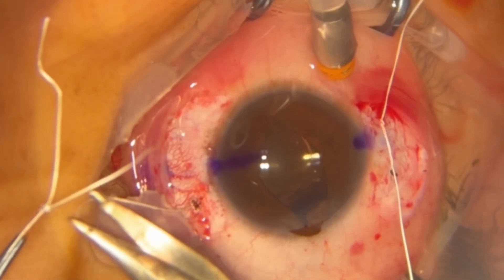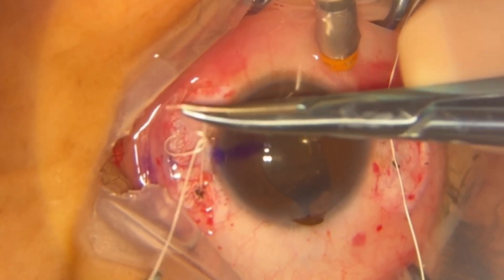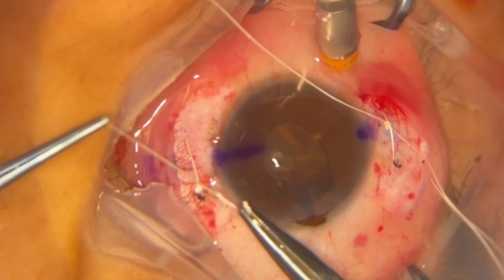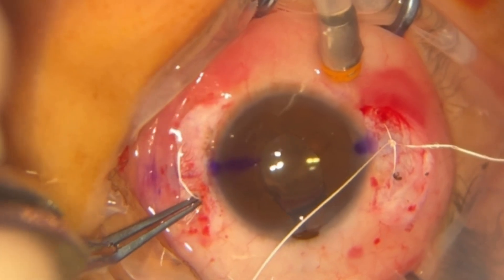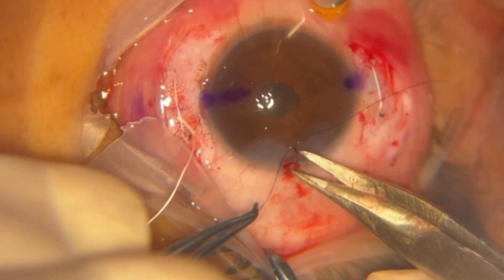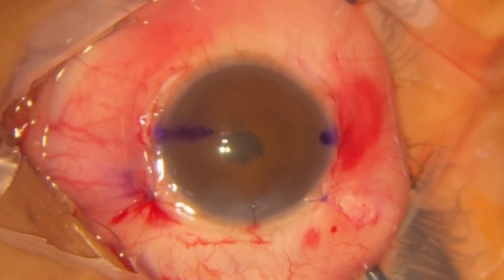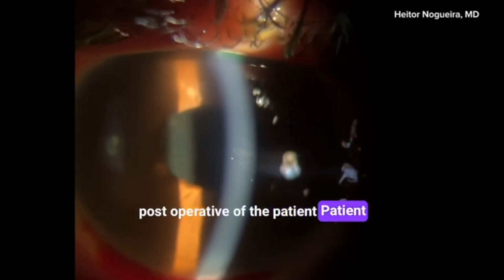A knot is then tied using the 3-1-1 technique bilaterally, ensuring the lens is centered. The knots are buried in the sclerotomies, and the conjunctiva is sutured. An excellent postoperative result can be observed.